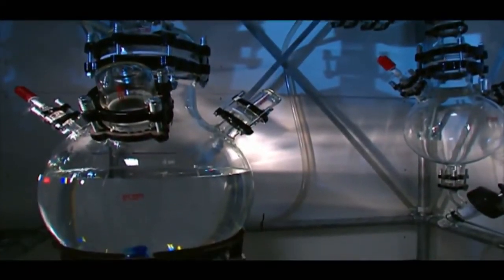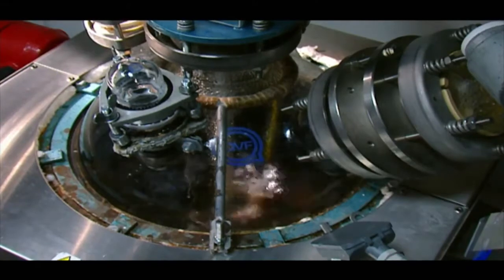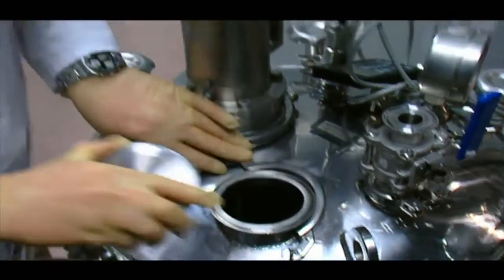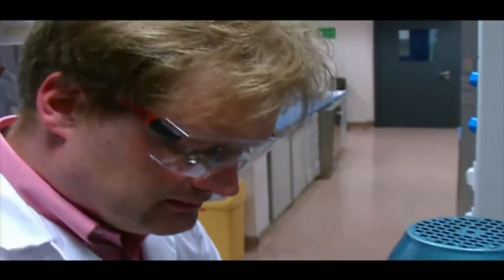The acrylic is distilled and purified and mixed in giant blenders. The process bears a passing resemblance to another traditional Irish pastime. Outside of the whisky factories, this has got to be one of the biggest stills in Ireland, and it's legal.